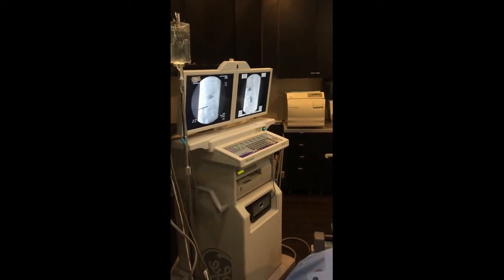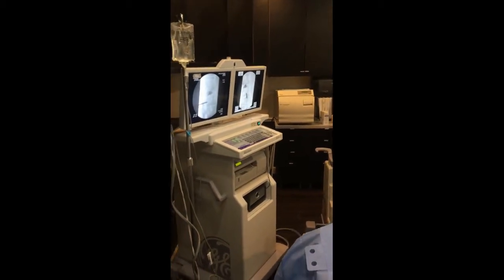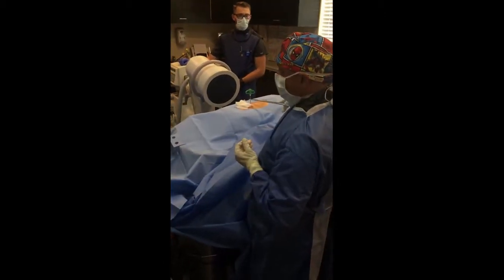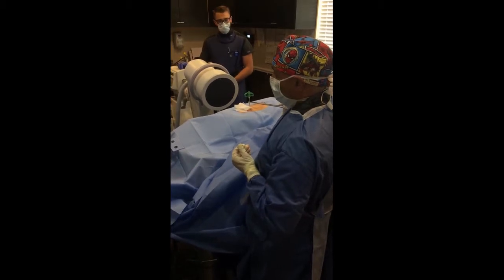Do me a favor, Dr. Chen, can I get a couple more taps here, please? Absolutely. Ma'am, are you doing okay? Yeah. Okay, great. And the patient is doing great. She's been numbed up with plenty of local anesthetic.